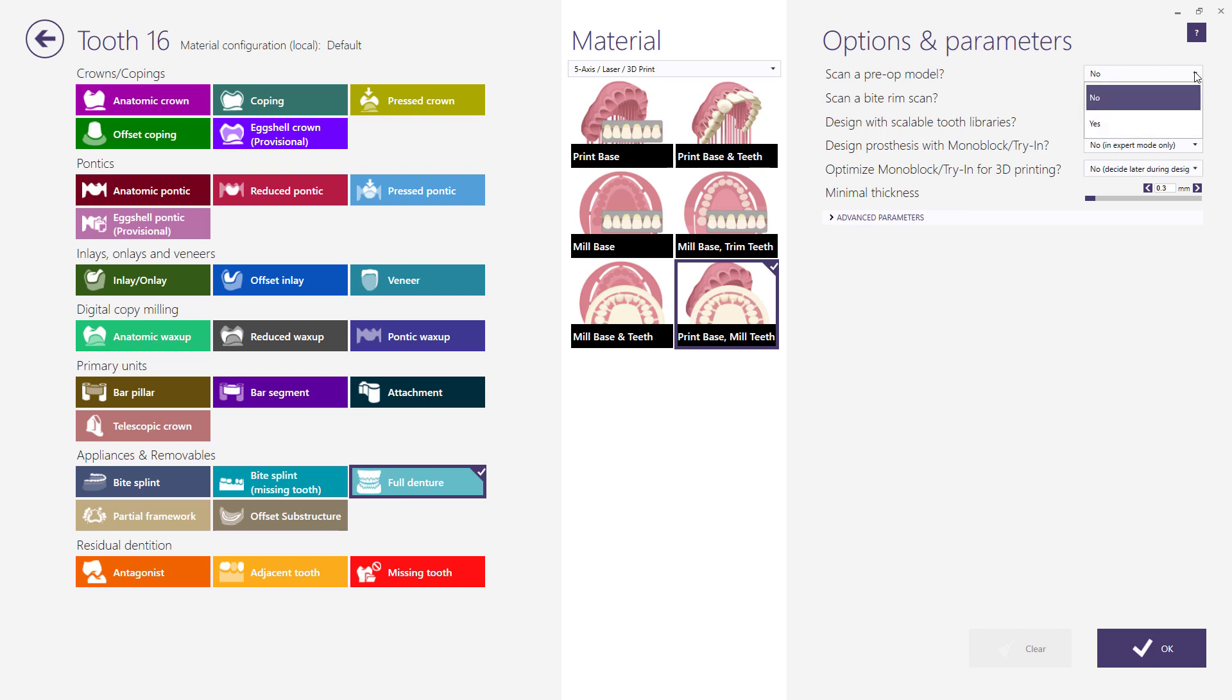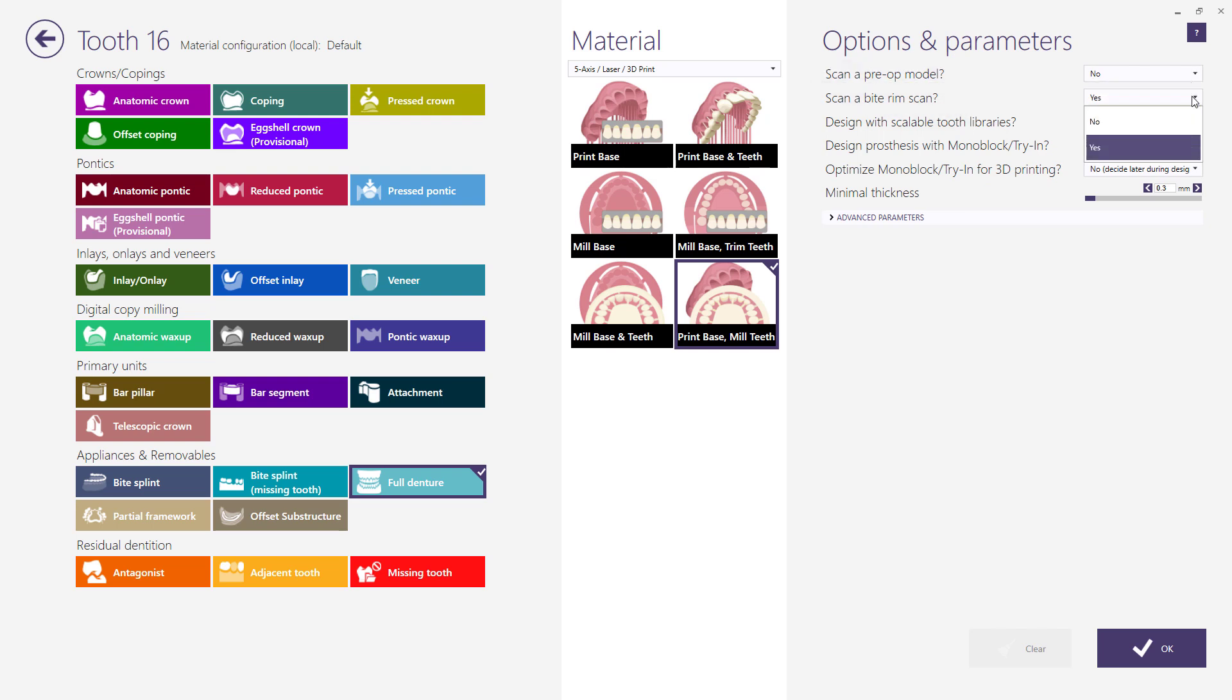Under the options and parameters, you can choose to scan a pre-op model or a bite rim. Note, bite rim scan is not needed for single arch denture and the model analysis will be done on antagonist.